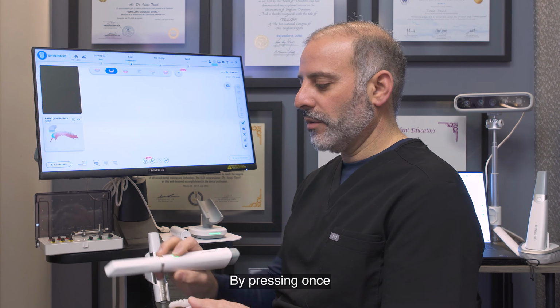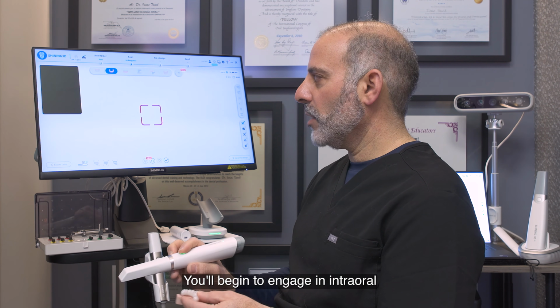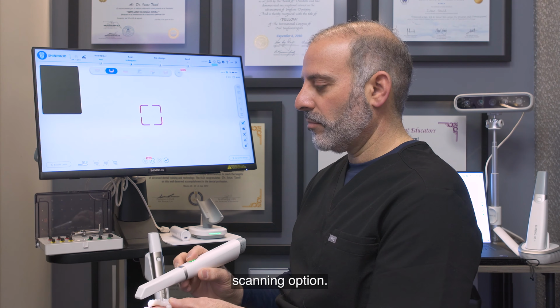By pressing once on the Elite, we'll begin to engage the intraoral scanning option.